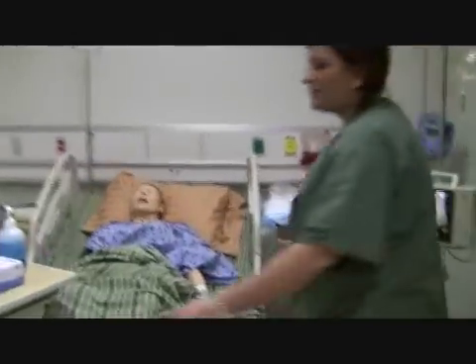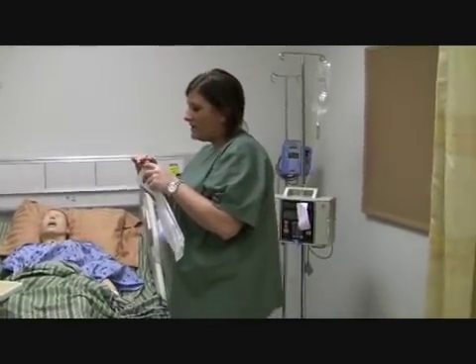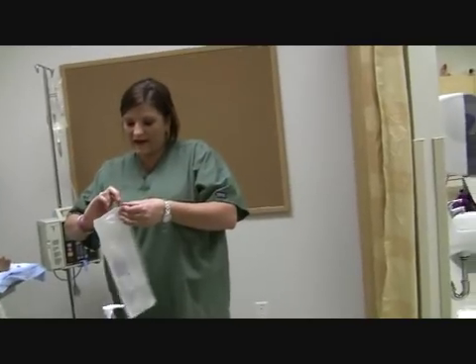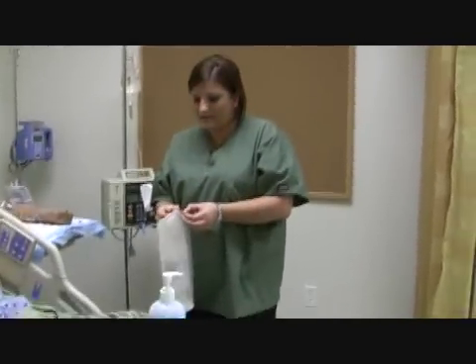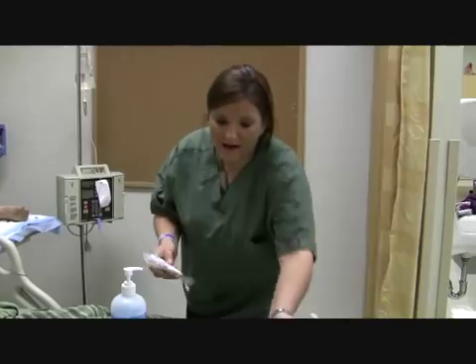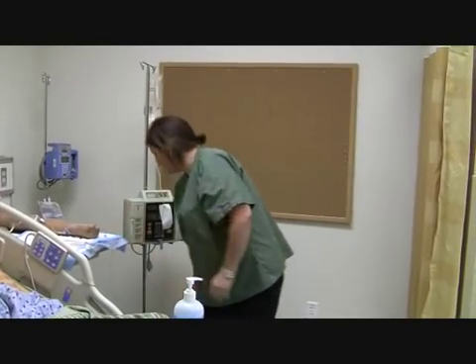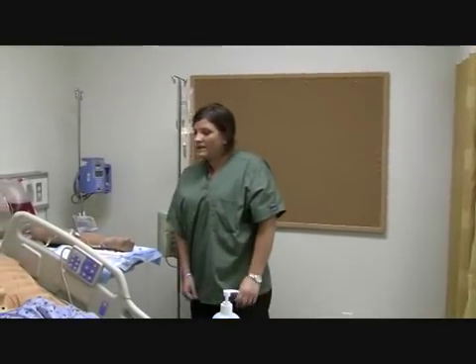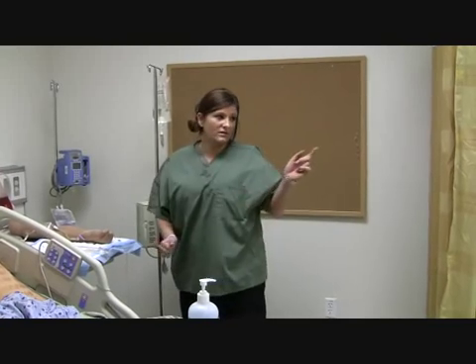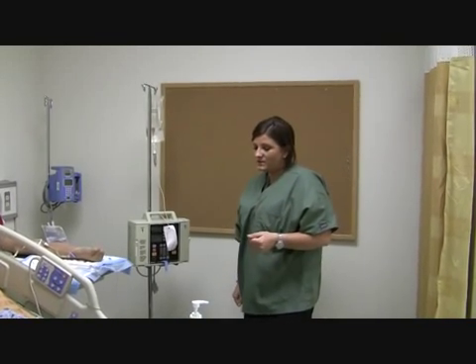Alright, so what I'm going to do is make sure all this is, like I said, not expired. I'm going to open the tubing and make sure there's no problems with that. And then we're going to do 5 things before we go get the blood, which is we're going to establish our baseline vitals, and then we're going to start our IV. So we're going to start the saline, then we're going to make sure that we have our consent form signed, which is in the chart, so I'm going to need that. And we're going to make sure that that gets signed, and then we're going to do a patient teaching.